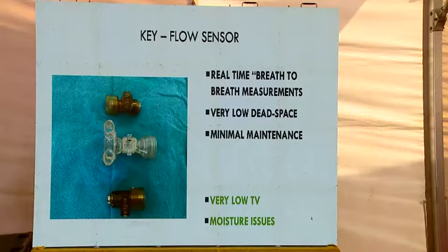But for a 1 kilo baby, in the last talk it was mentioned that 4 to 6 ml is the tidal volume. So it is only 5 ml. So if the flow sensor is inside the machine, that may be lost. So to calculate the volume and flows precisely, your flow sensor should be near the tip of the endotracheal tube, A, and B, it should not be alarming, it should be calibrated. So this is first and foremost thing.